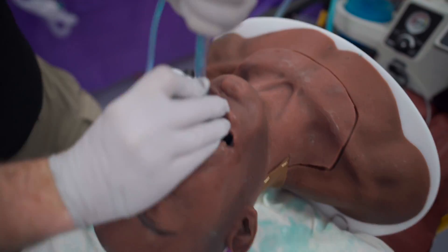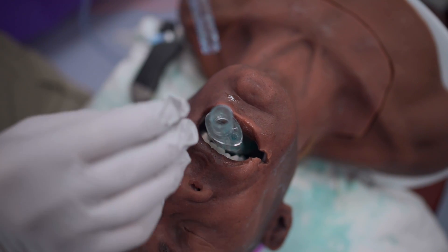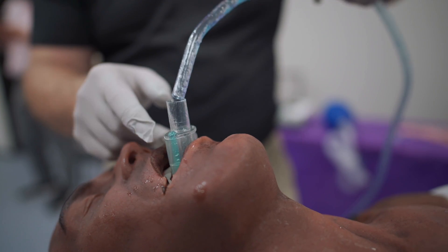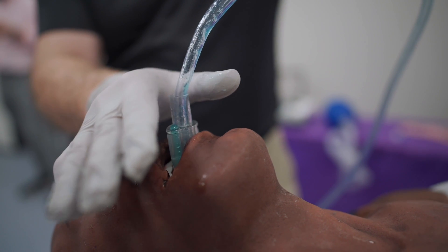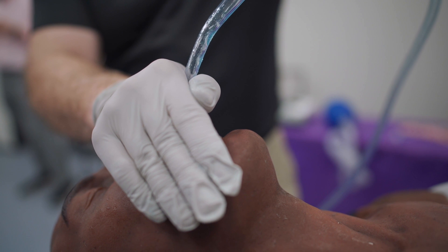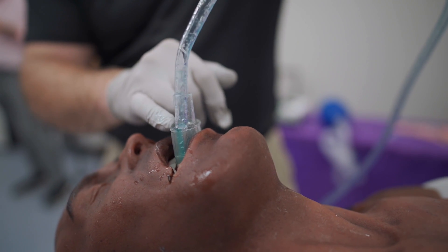I'll place the airway and then perform a rapid airway decontamination maneuver by placing the rigid suction catheter gently into the 15 millimeter connector and forming a seal with the ring of my hand. This uses the supraglottic airway itself as a suction device.